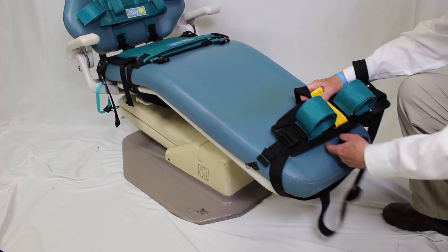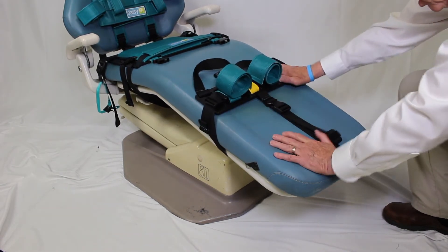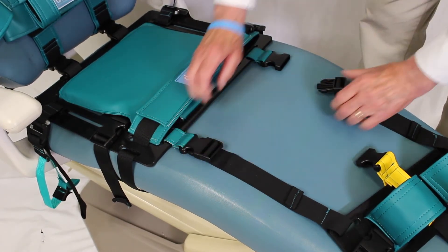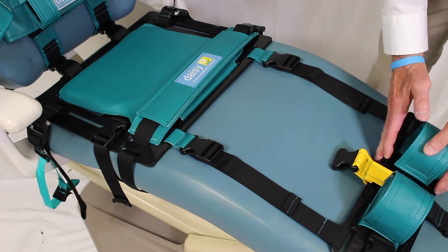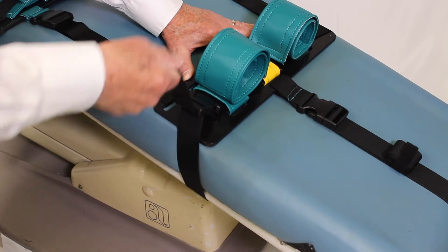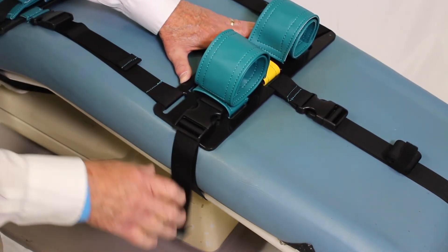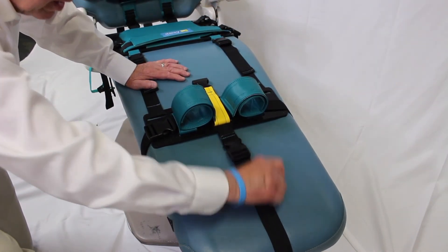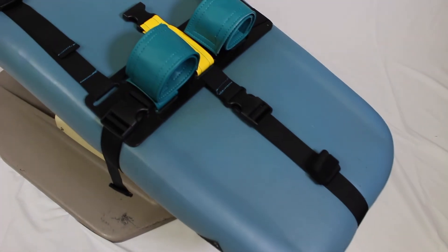Slide the leg strap loop with base onto the bottom cushion. Position the leg strap base to the desired position to fit the length of the patient's legs. Connect the two length control straps and tighten. These straps are designed to control the length between the seat base and the leg straps. Tighten the leg strap base to the seat cushion by pulling the strap end up and towards you. Once the leg base is in place, prepare to attach the lower length control strap. Do not connect and tighten until the length control straps are attached and tightened. This will secure the leg strap base in place.